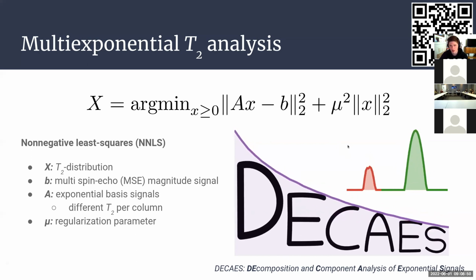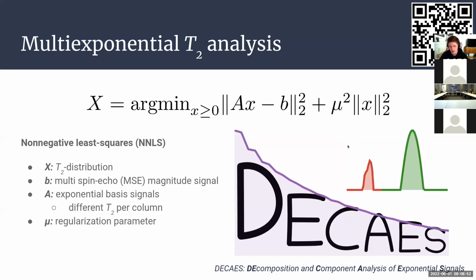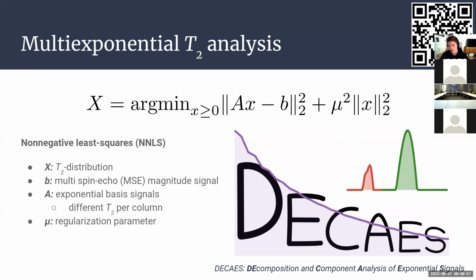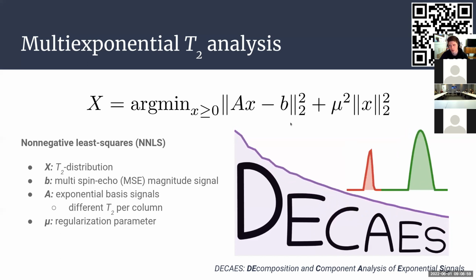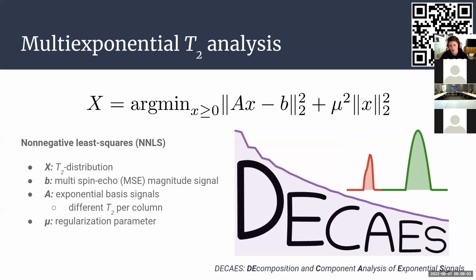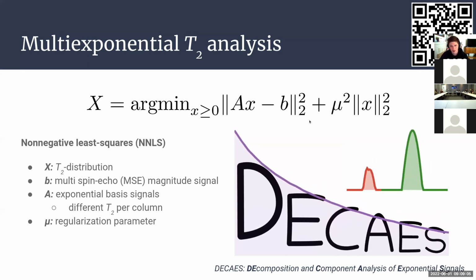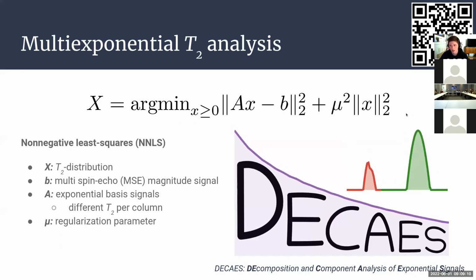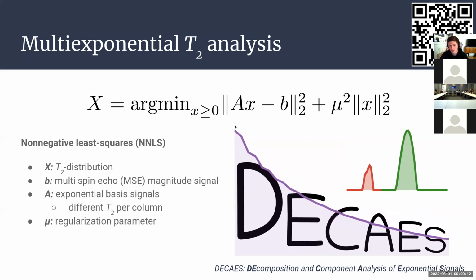I think I'm already going to pause quickly because this is basically the only overview of the math behind the case for the rest of the talk. From here, we'll mostly just talk about how to use it and what the different parameters mean and such. So if anybody has any questions about the math, I am happy to answer that now. Otherwise, we will keep powering through to the rest of the talk.